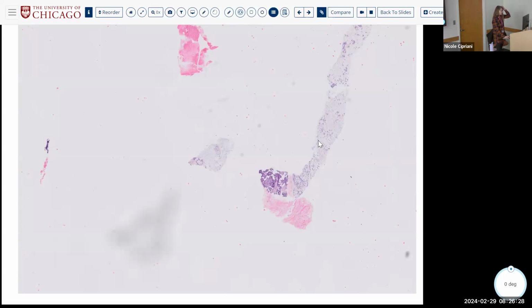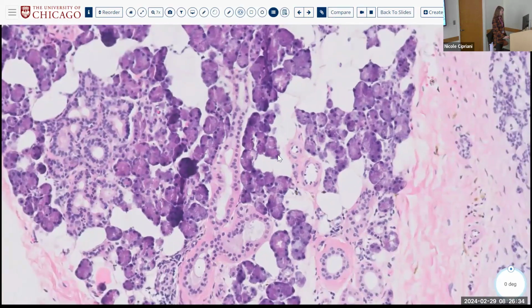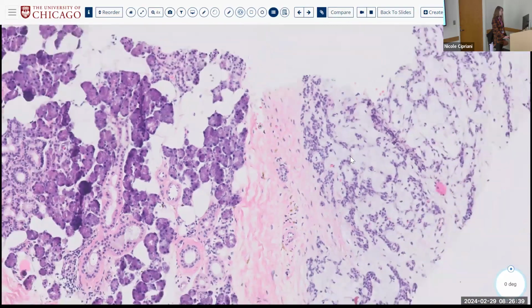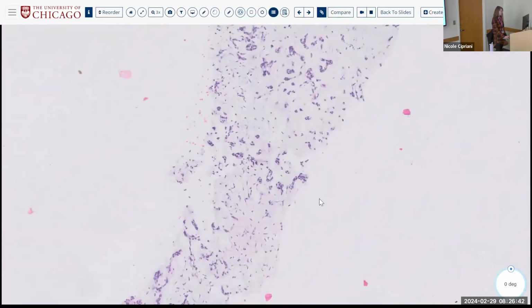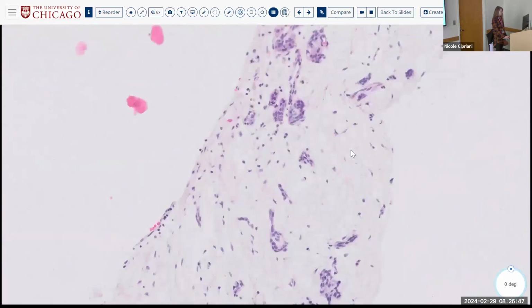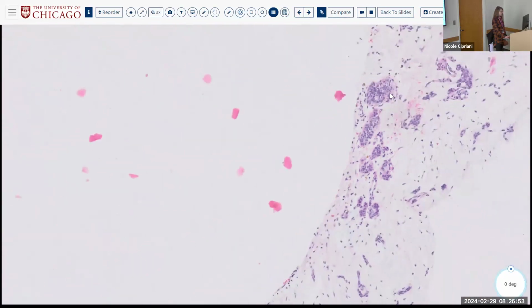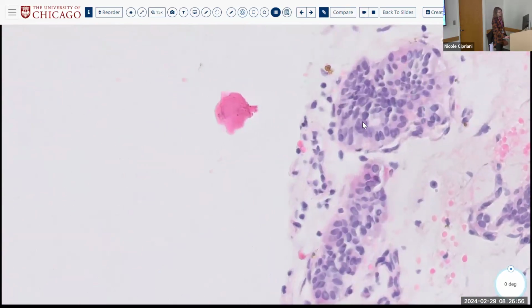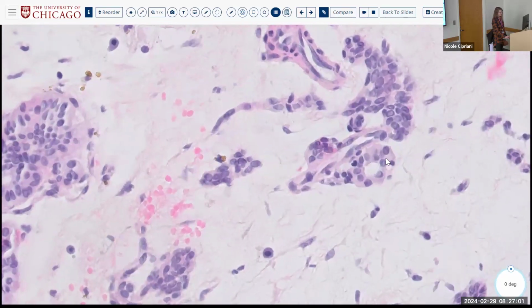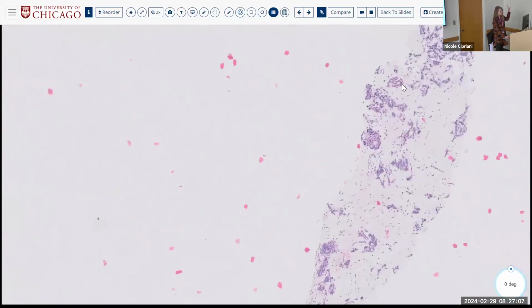Okay. So here's a core biopsy. Let's see if we can tell where we are. Where do you think we are? Parotid, because we're all serous, okay. And then we have a neoplasm that has predominantly myxoid stroma with small gland-looking cells in it, very fine chromatin, no nucleoli. Maybe there's a duct punctuating here and there. So all things considered, what is an adequate diagnosis in this case?